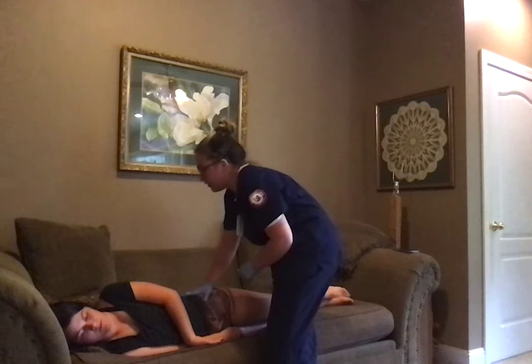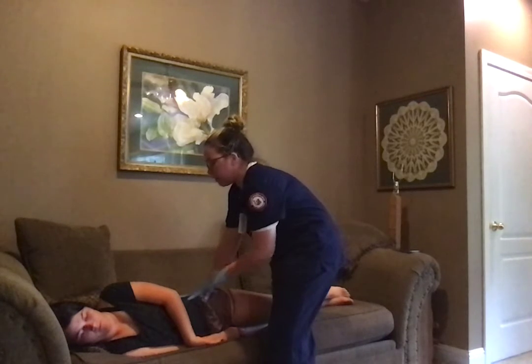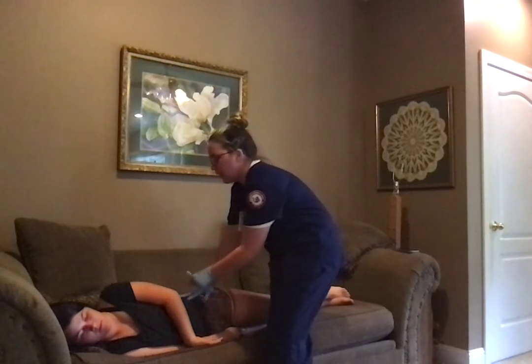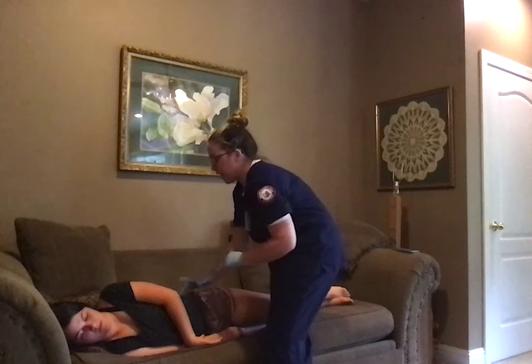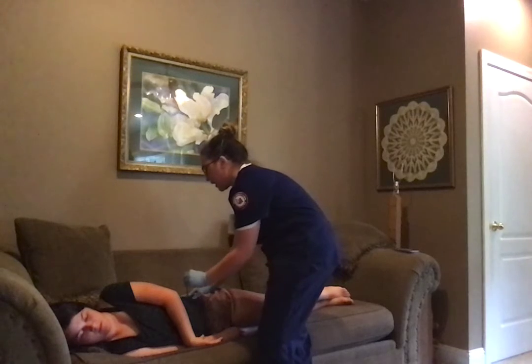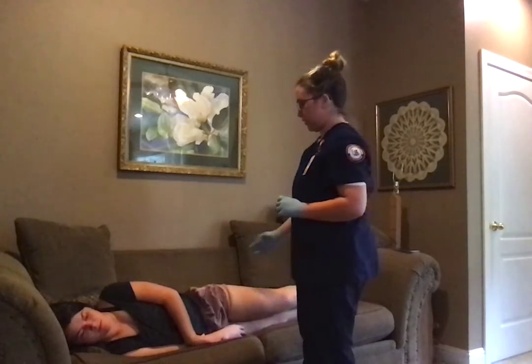So once I've located this area, I'm going to clean with my alcohol swab, and then I would leave my alcohol swab on the patient pointing towards my injection site that I've picked so that I can readjust my hand to get a better angle, and then I would give this injection at a 90-degree angle since it is intramuscular.